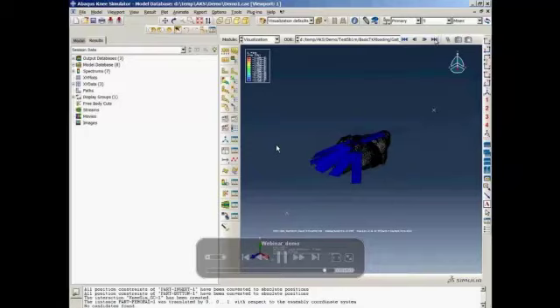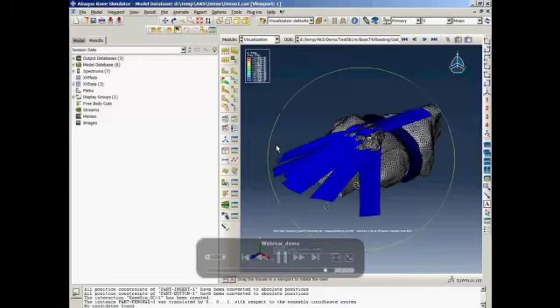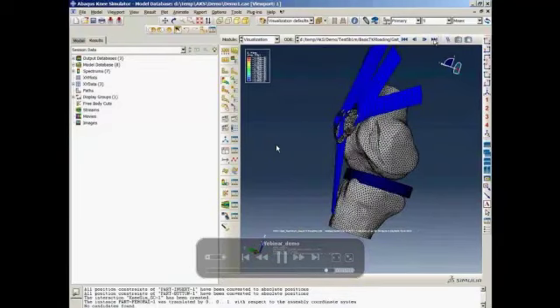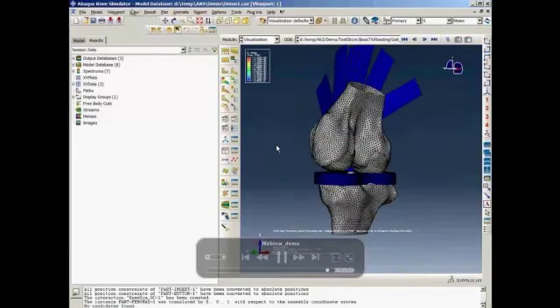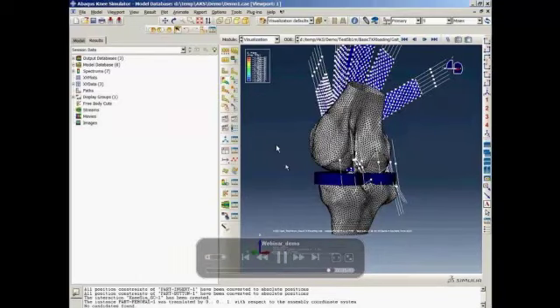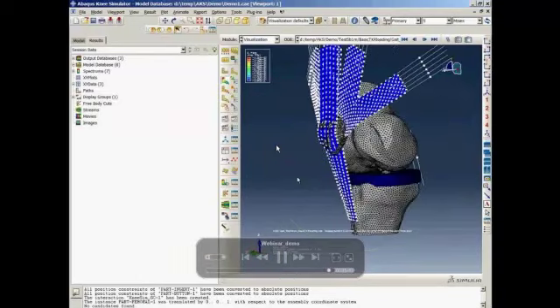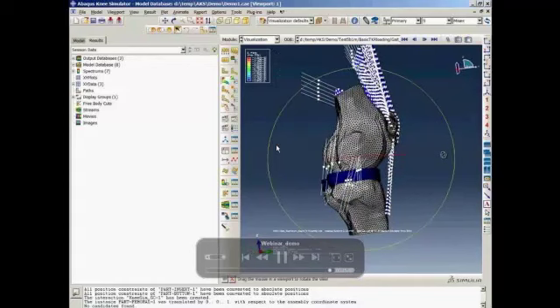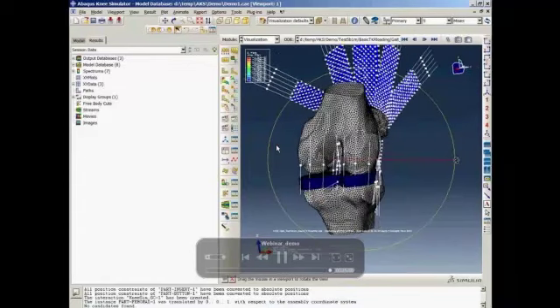So I look at the assembly of the models, and to visualize, since in this case the ligaments and tendons are mostly represented as 1D, I have to visualize the connectors to be able to show where the ligaments and tendons are. So to access that, I went to the view options, ODB options, and turned on the display of all the connectors, which are the elements used for modeling these ligaments and tendons. So as you can see, the MCL is not really in the model. So I suspect the intern has cut that ligament.